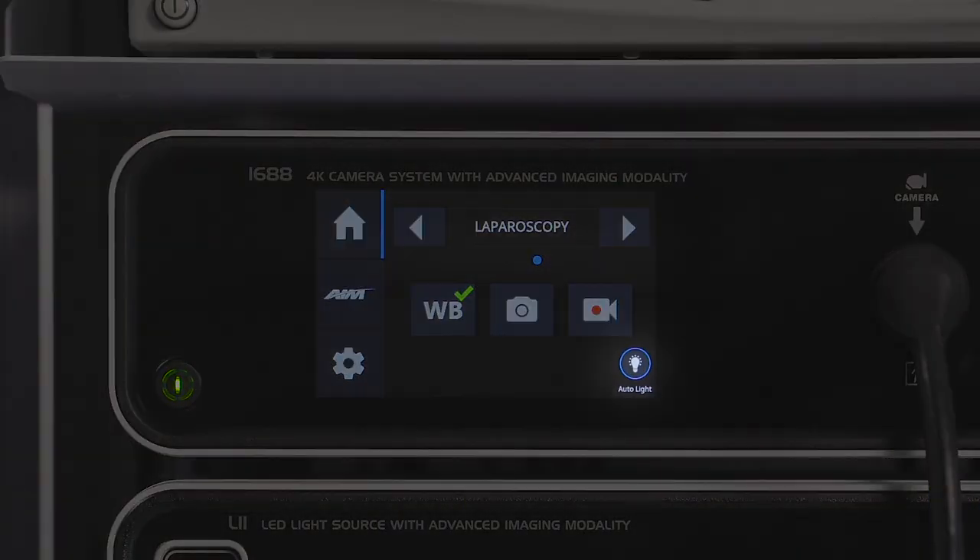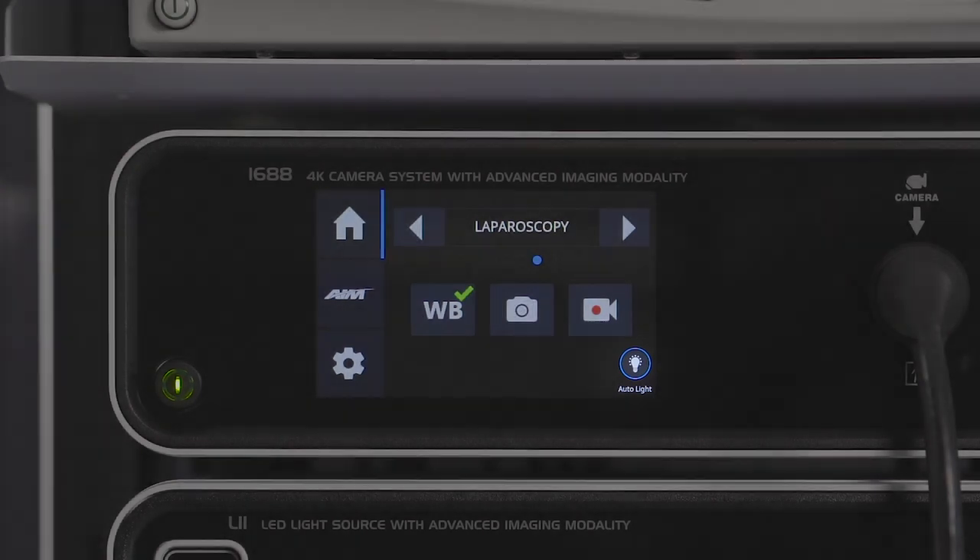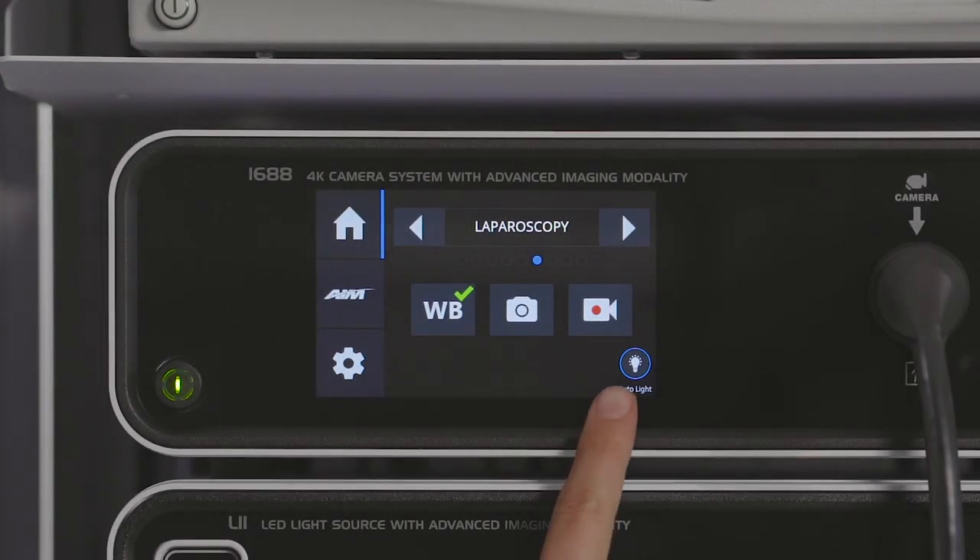Autolite is a feature improvement exclusive to the 1688 AIM 4K system. Press the Autolite icon to toggle Autolite on or off. The L11 LED light source console displays a status icon; however, Autolite is controlled from the CCU.